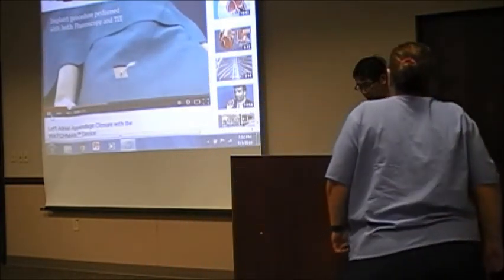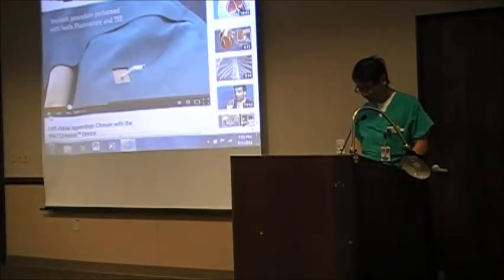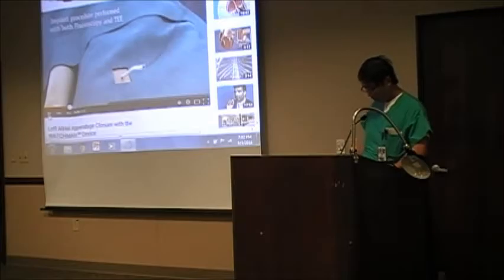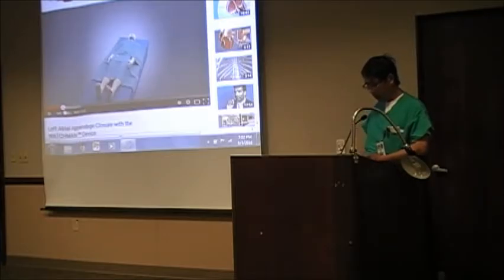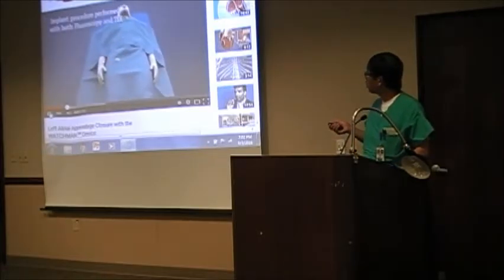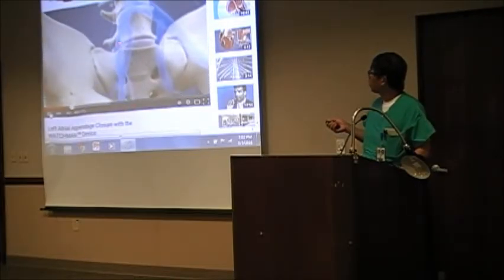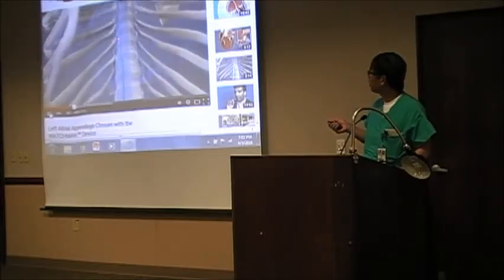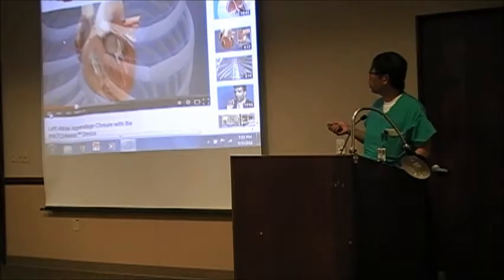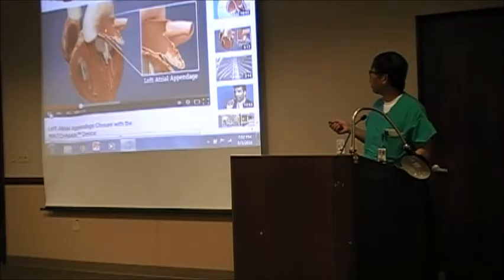Let me start this. Oh, I can explain it, even though I never do it. So usually the patient lies on the cath lab table, all right? We dress up, we put the catheter in first. So we choose the femoral veins and put the sheath in from the vessels to the heart. We reach the right side heart first. Okay, and the appendage we try to close is in the left.